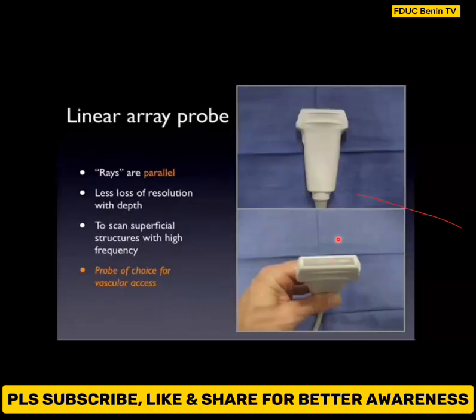Then we have the linear probes. A linear probe usually uses high frequency, so it is used to scan superficial structures. It is the probe of choice, for example, for vascular access, such as in a patient on dialysis, and for ultrasound of the eyes, muscles, or hands. If you don't need depth, the linear array probe is very important.